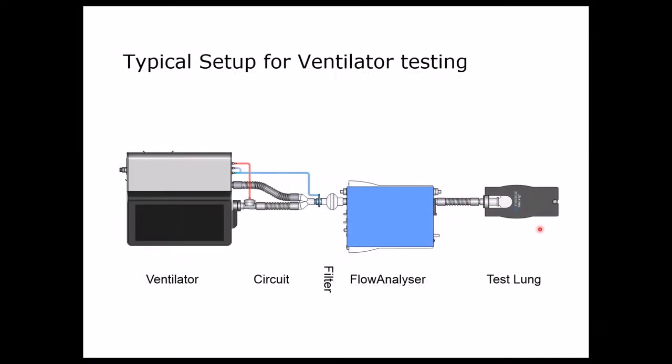This is a typical setup we have for the PF300. We have a ventilator or anesthesia machine with its conventional setup and conventional circuit, then we have a filter and the PF300 which measures everything delivered to the test lung or coming back from the test lung. This is a typical setup for ventilator testing, usually used for annual maintenance.